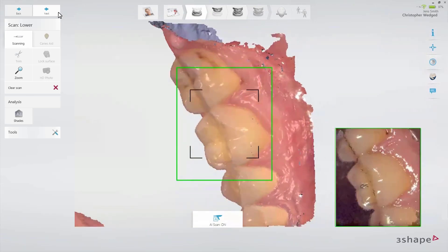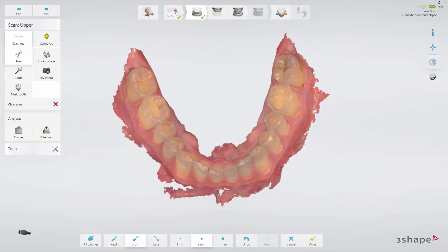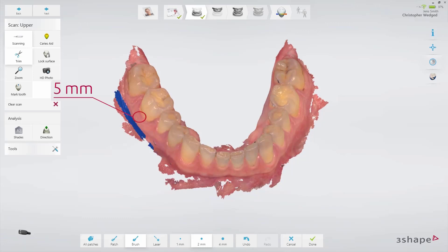Either use the tip to keep the tongue away or enable AI to suppress unwanted soft tissue. Roll over the last molar and scan the buccal area for the whole jaw. Inspect the scan when completed and make sure to capture at least 5mm of additional space between the margin line and the soft tissue.